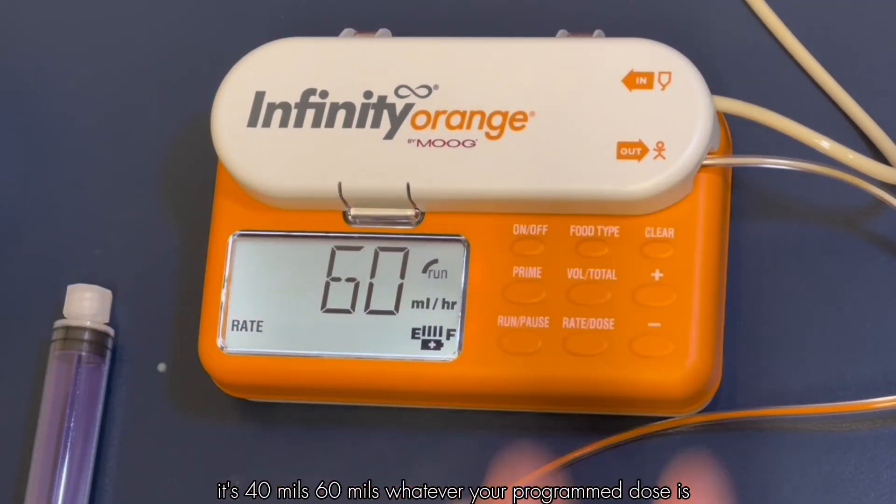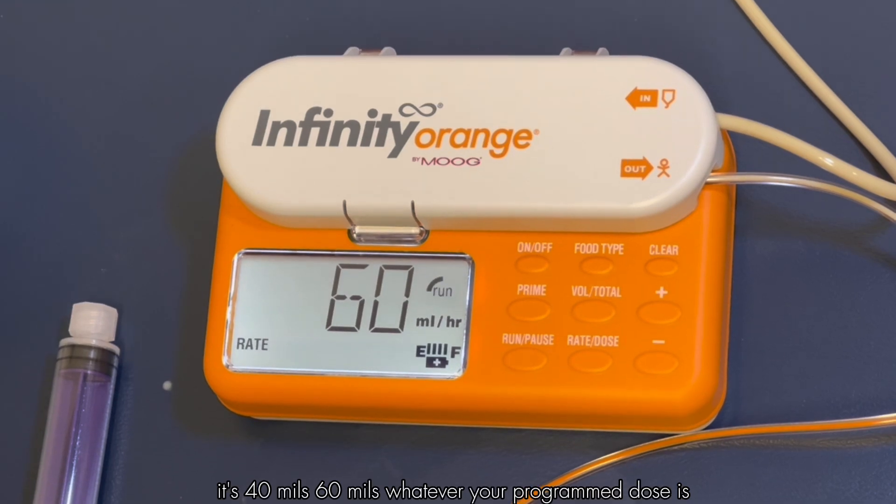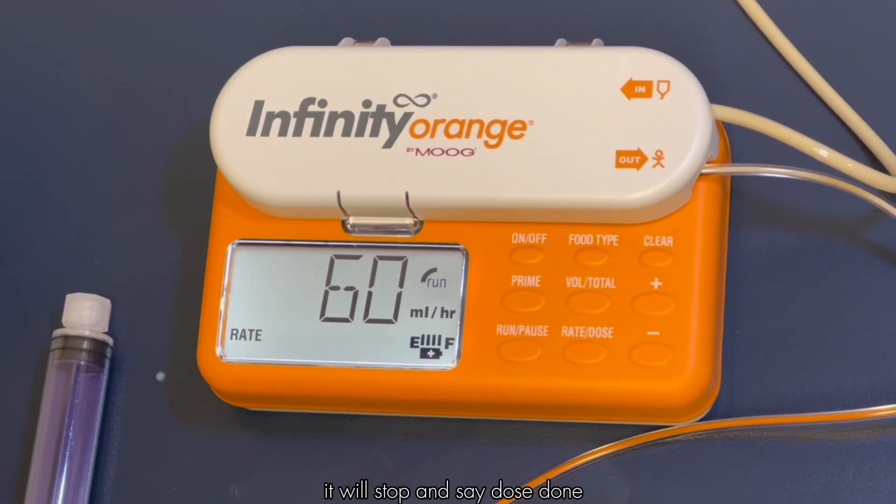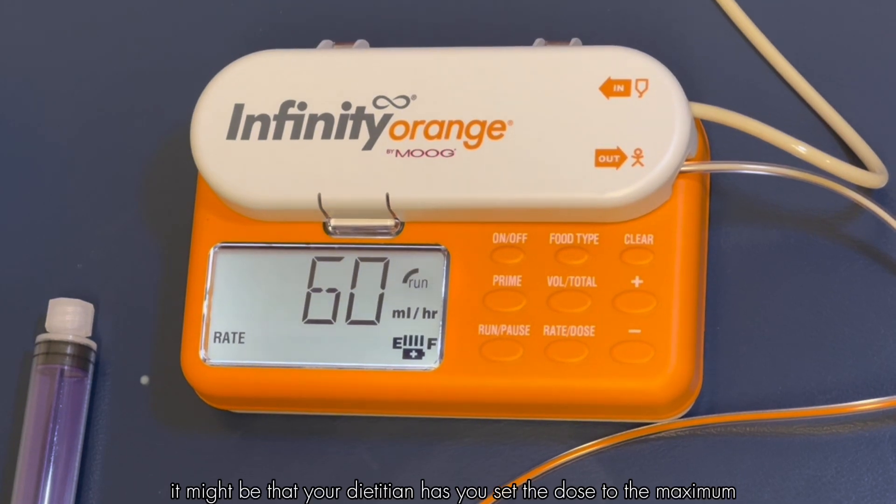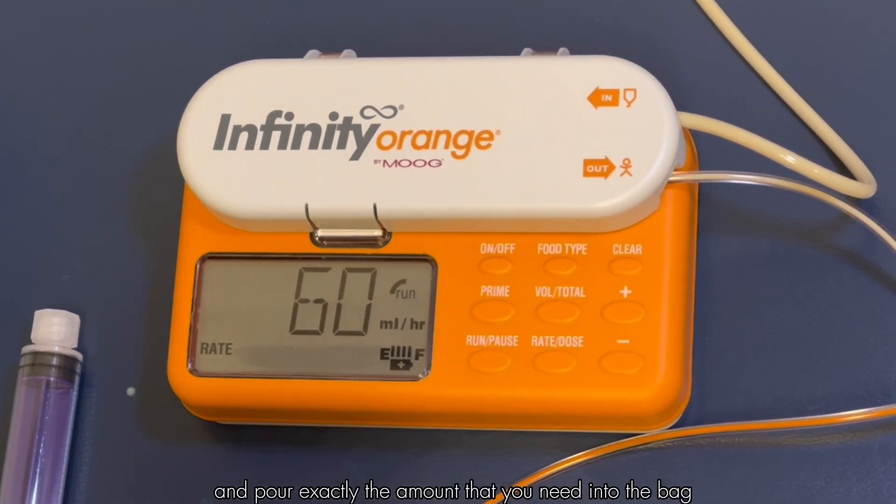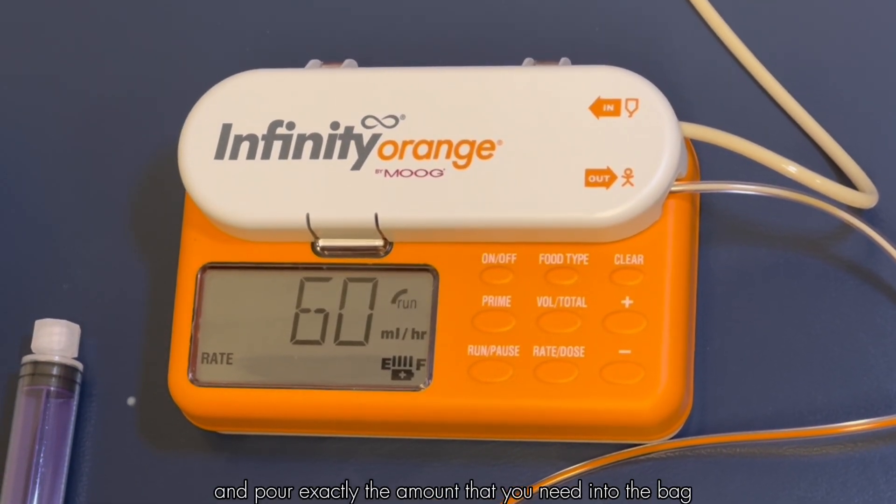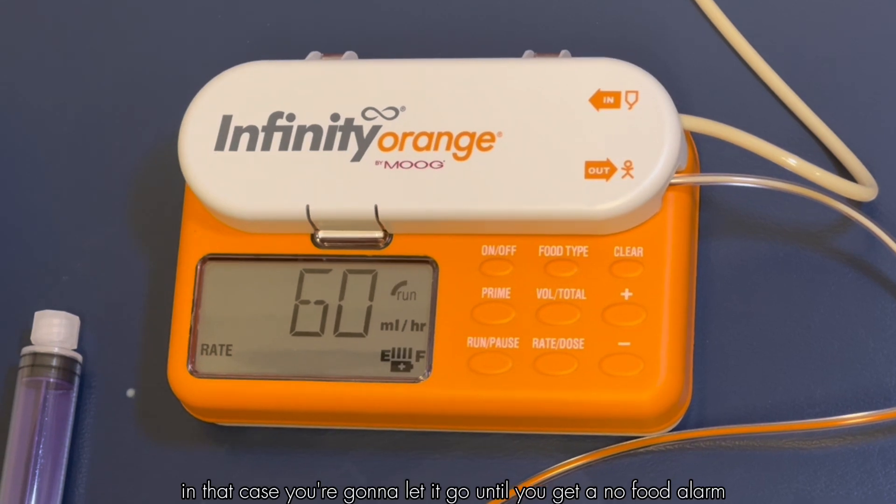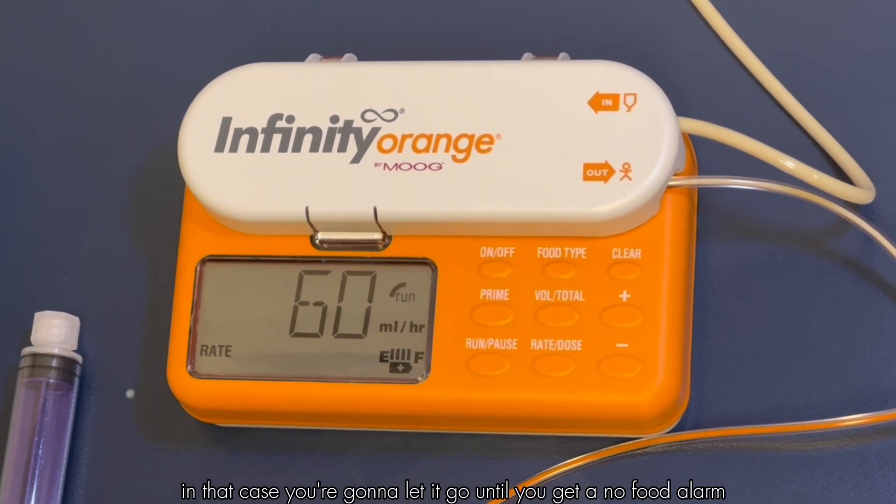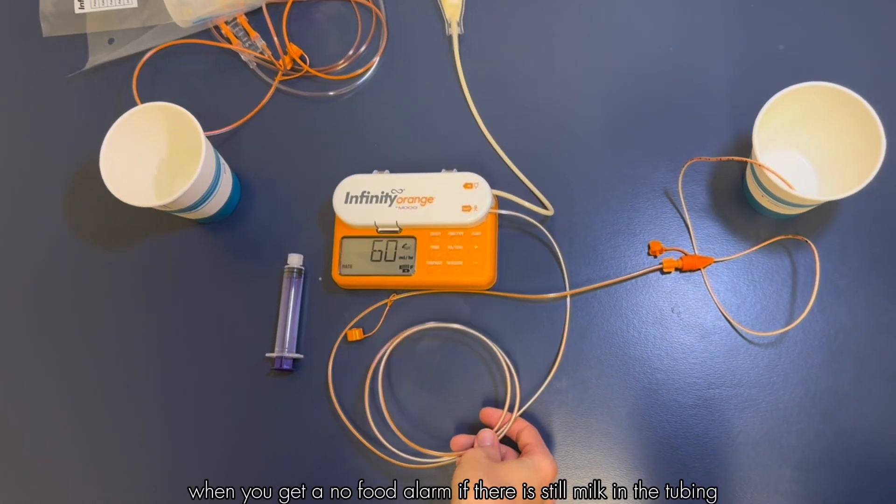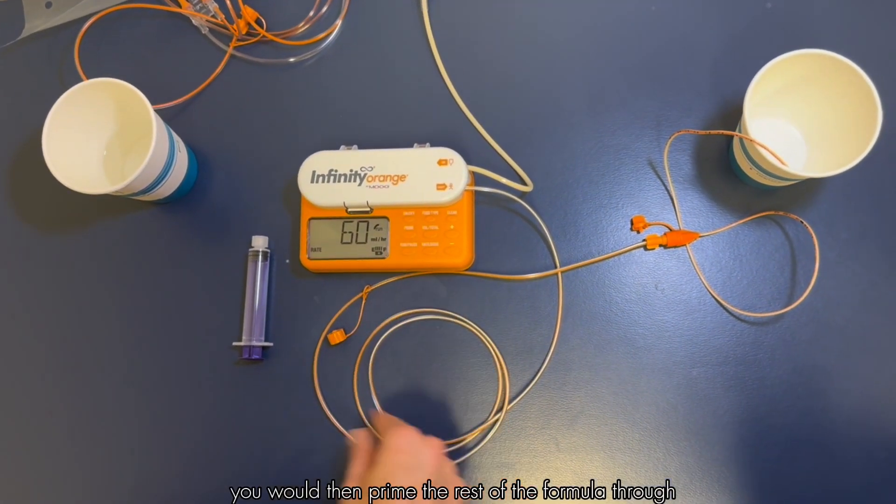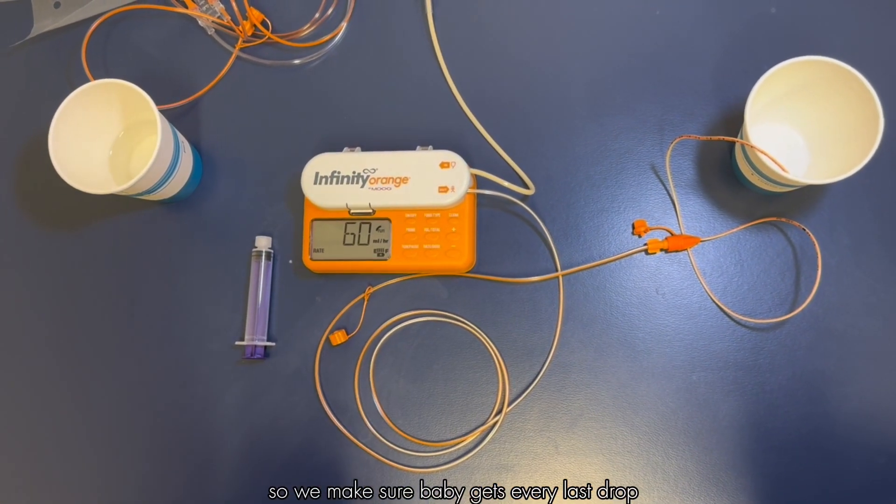Typically we're going to let it go and then the thing that will stop the pump is going to be that dose done alarm. Once it pumps its 40 mil, 60 mils, whatever your programmed dose is, it will stop and say dose done. Now it might be that your dietitian has you set the dose to the maximum and pour exactly the amount that you need into the bag. In that case you're going to let it go until you get a no food alarm. When you get a no food alarm, if there is still milk in the tubing, you would then prime the rest of the formula through so we make sure baby gets every last drop.